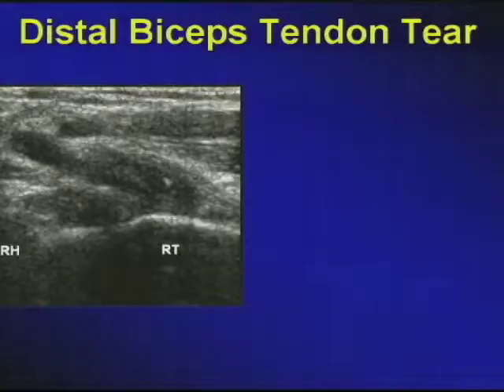When there is a violent rupture of the distal biceps tendon, usually in a patient with flexed elbow against forced extension, this is what you get to see. First, the bone acoustic landmark of the radial head, radial neck, and then finally the radial tubercle. As we have told you before, all tears of distal biceps tendon must occur at the insertion into the radial tubercle.